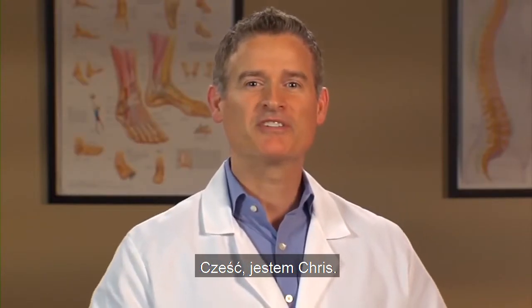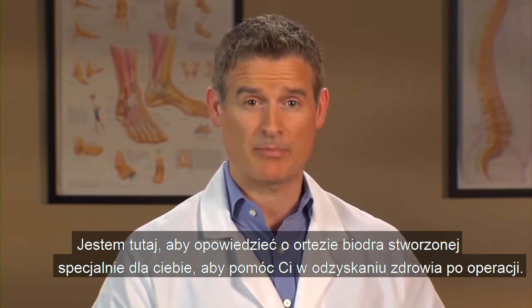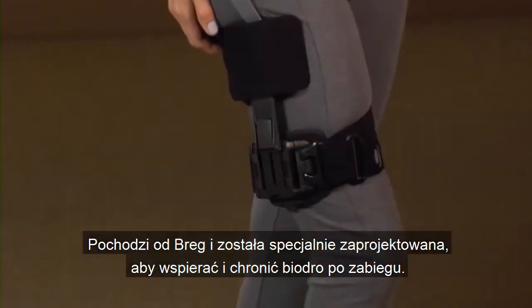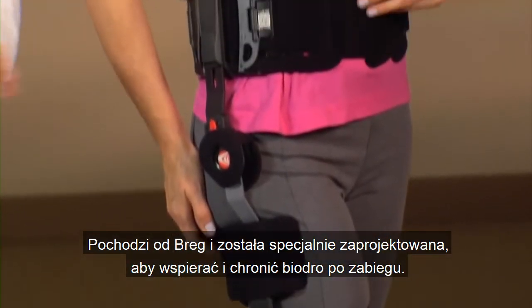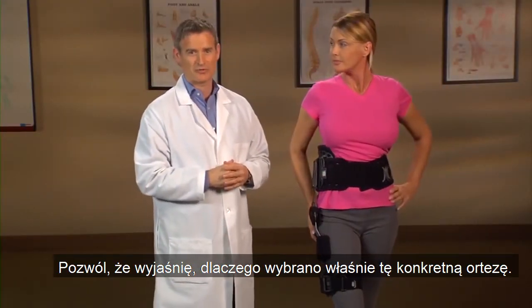Hi, I'm Chris. I'm here to tell you about the brace chosen specifically for you to help with your post-operative recovery. It's called the T-Scope hip. It's from Bregg and it's specially designed to support and protect your hip after surgery. Let me explain why this particular brace was chosen for you.